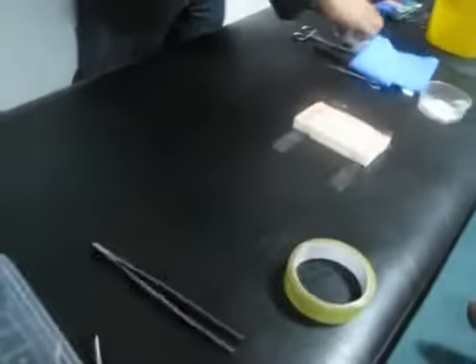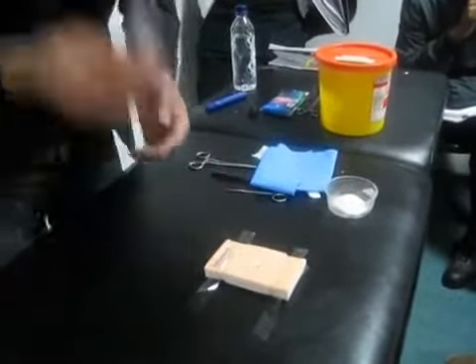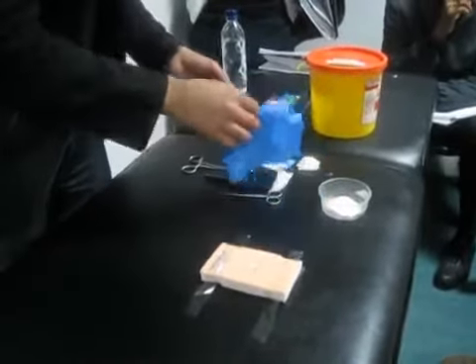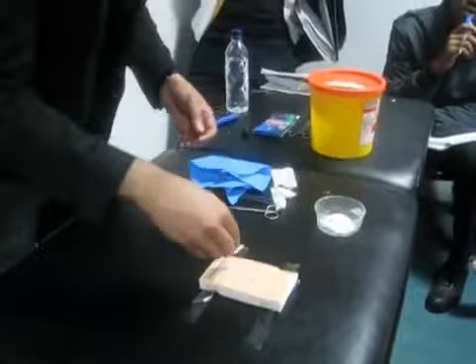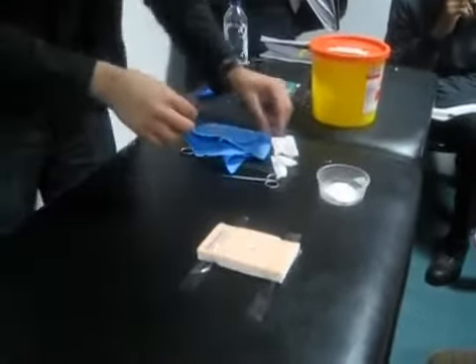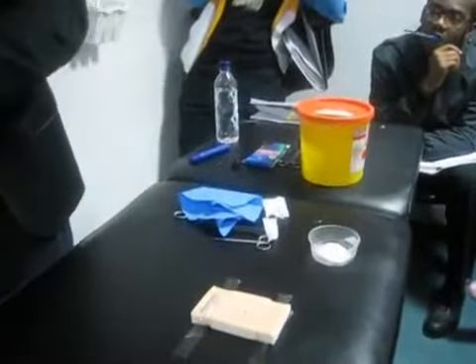Sending instruments for sterilization. I'll take off the outer pair of gloves.